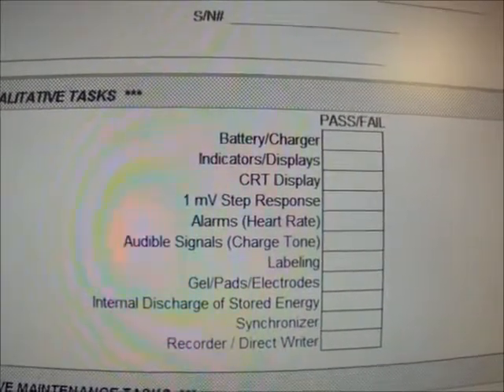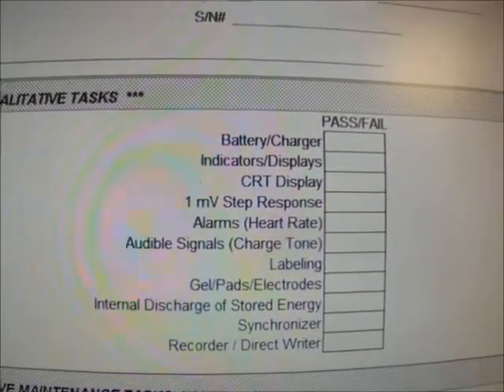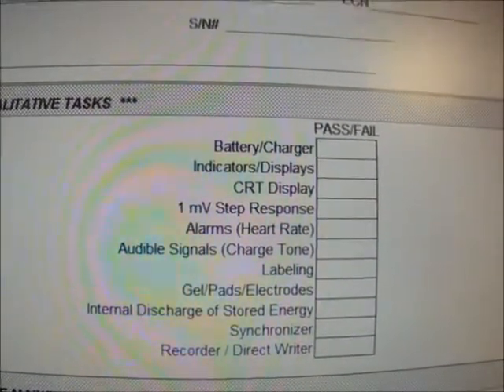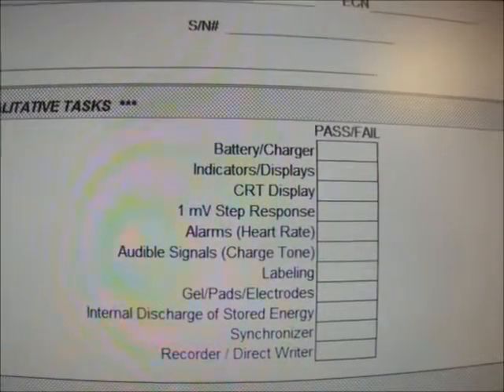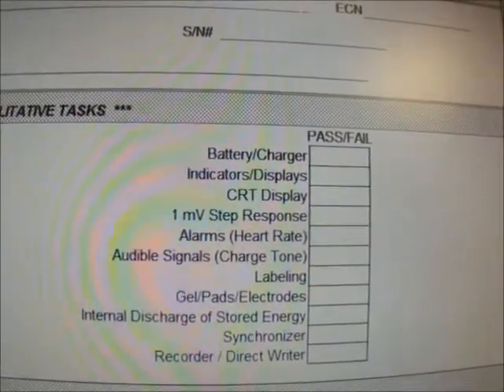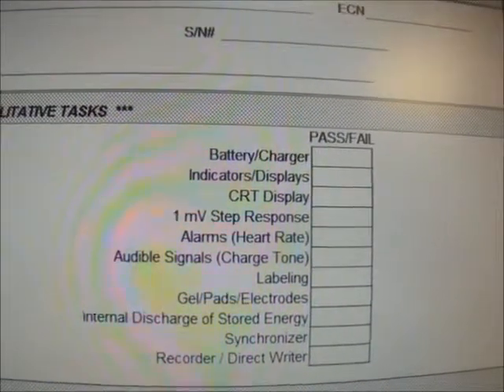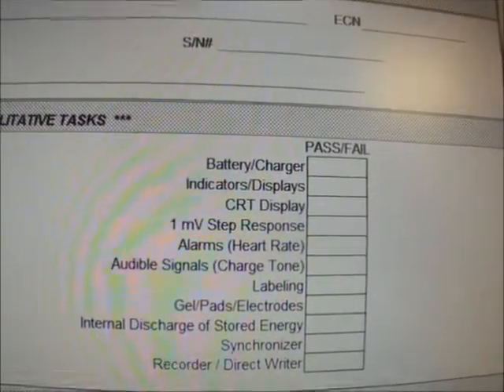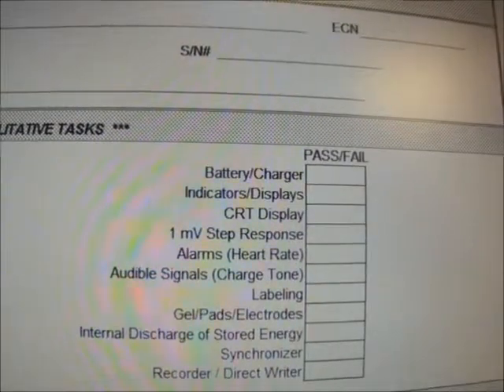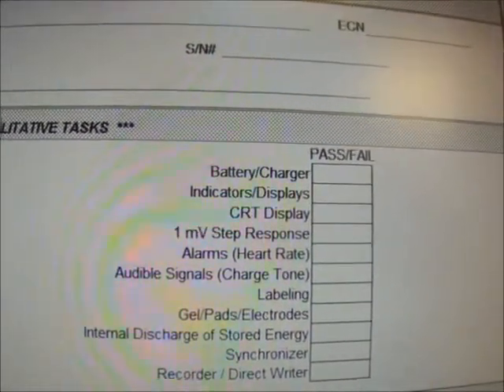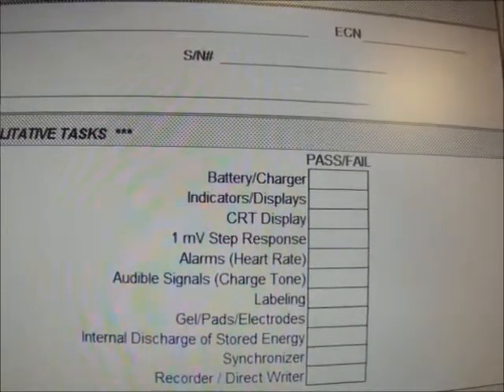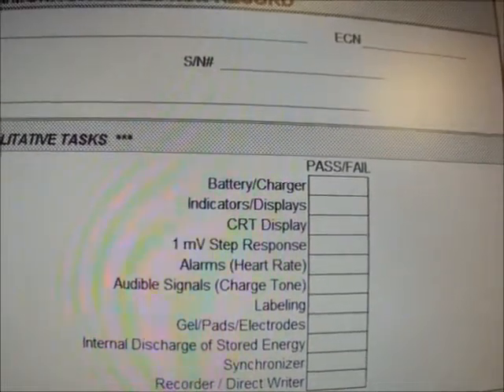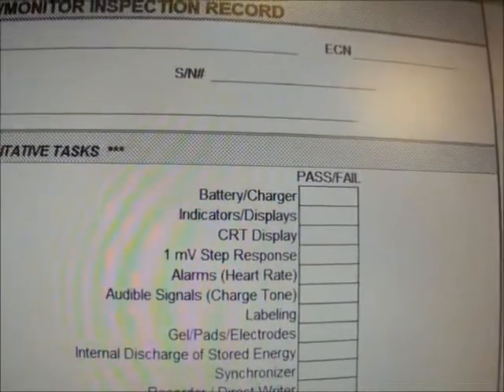At a paper speed of 50 millimeters per second, ten blocks span one second, or 60 blocks for every six seconds. Most ECG charts mark off every 7.5 centimeters along the upper margin, corresponding to a three-second interval at 25 mm/s and a 1.5-second interval at 50 mm/s. For example, at a paper speed of 25 mm/s, a six-second strip is selected between the black arrows. If the number of heart cycles counted is seven, then heart rate equals seven times ten, or 70 beats per minute.